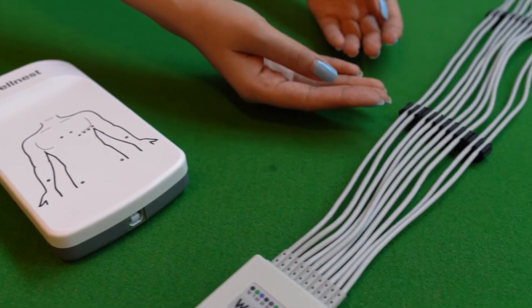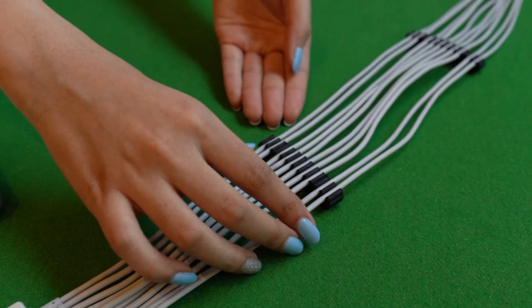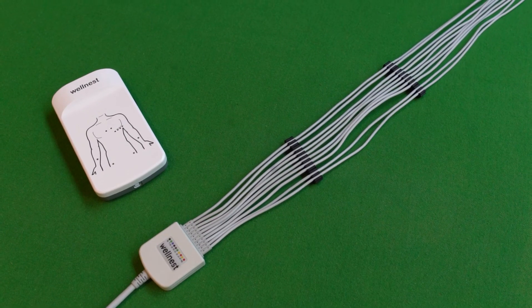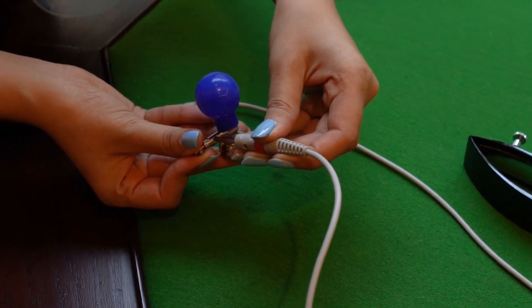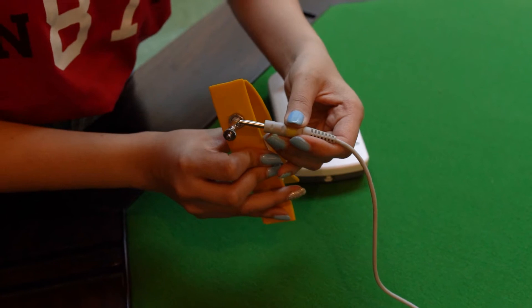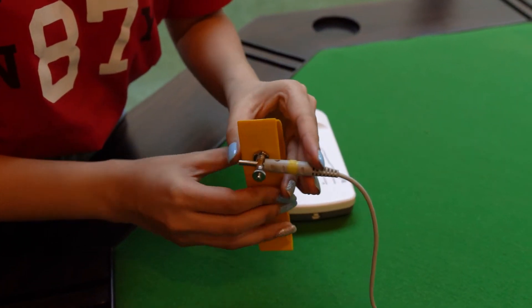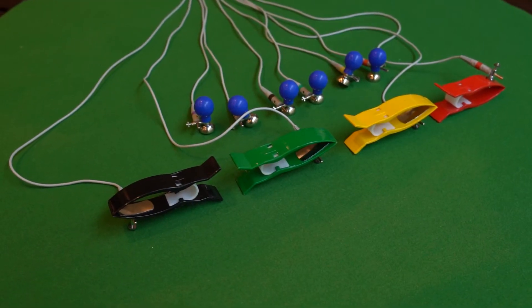Prepare the cable for use by attaching the cable management holders included in the kit as shown. This will lead to less dangling. Then, attach the 6 chest bulbs to the wires denoted by V1, V2 until V6. Next, attach the 4 ECG clamps to the corresponding limb leads. You can simply match the colour of the remaining wires to the colour of the clamp for simplicity.